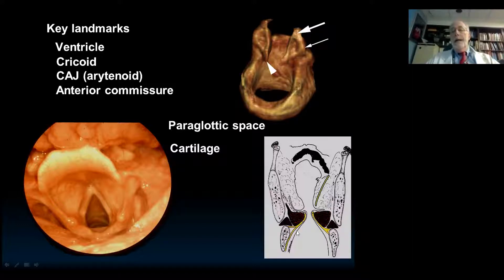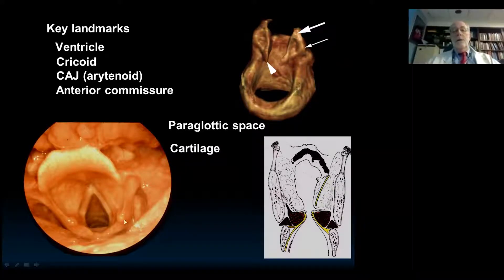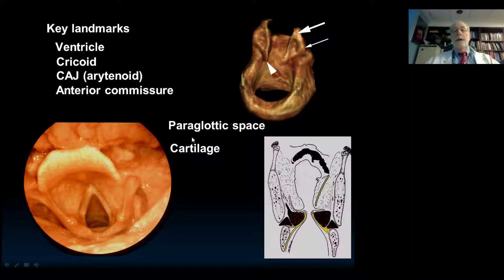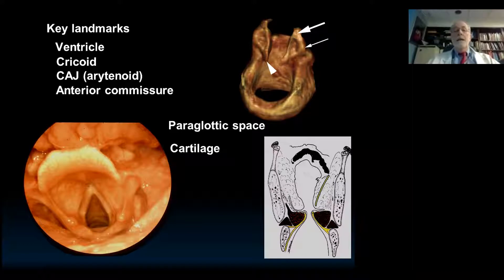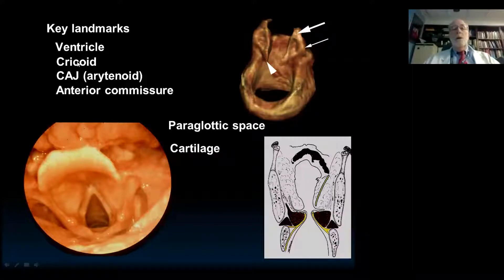The true cord ends about a centimeter below the ventricle and the rest is subglottis — we group the cord and subglottis together. The cricoarytenoid joint is off a little bit to the side. We come back to these landmarks over and over because they change the disease: lesions above the ventricle behave differently from those below. The surgery is different, and the lymphatic supply is different. All of these things are important in their own right.